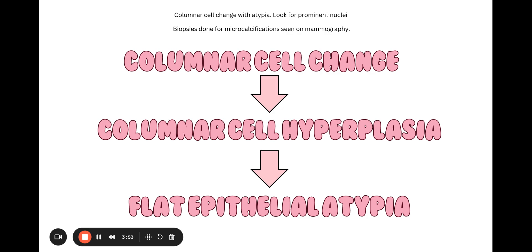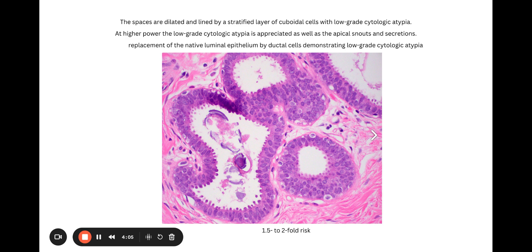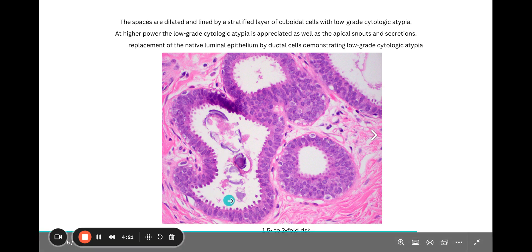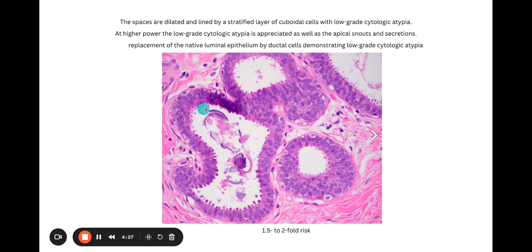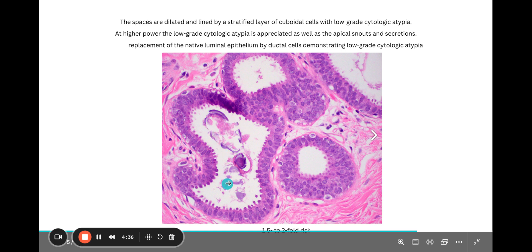The reason why these lesions are often found is because biopsies are done for microcalcifications on mammography, and that may actually just be due to FEA. When we're looking for the atypia, you want to look for prominent nucleoli. So you can see here at higher power a really nice picture of FEA. You can see that there is apical snouty — don't confuse that with apocrine metaplasia, which has more of an eosinophilic hue, whereas this is more bluish. And you can see the microcalcifications here very nicely.